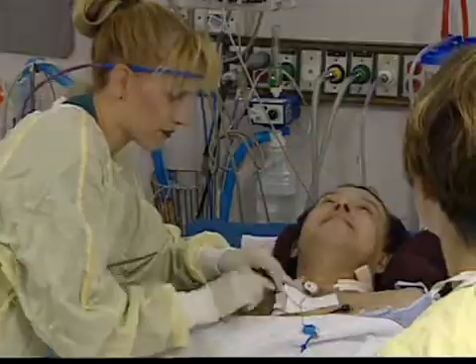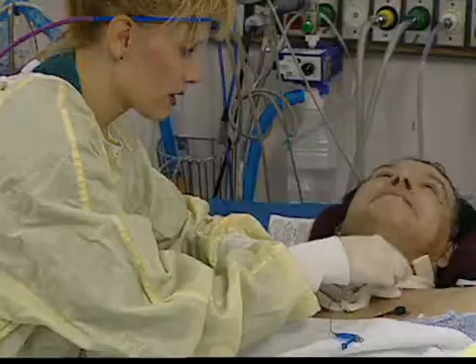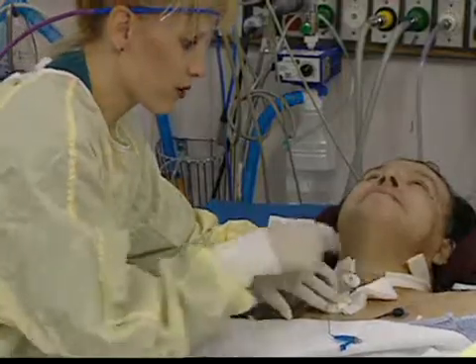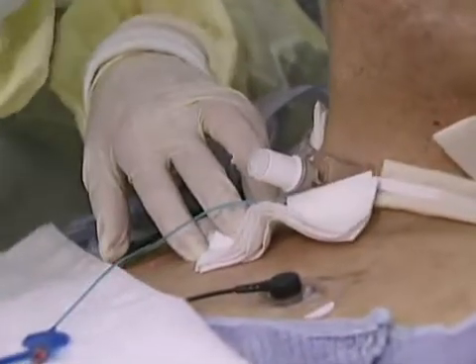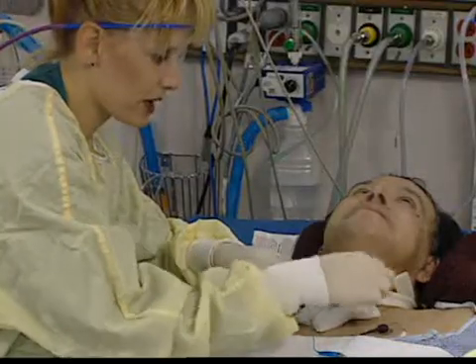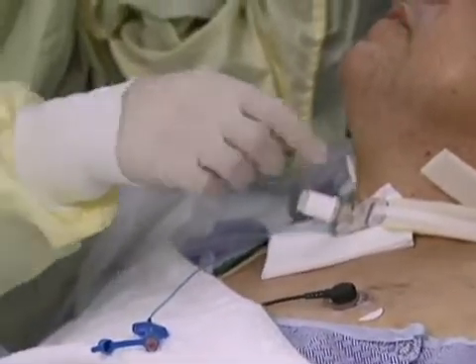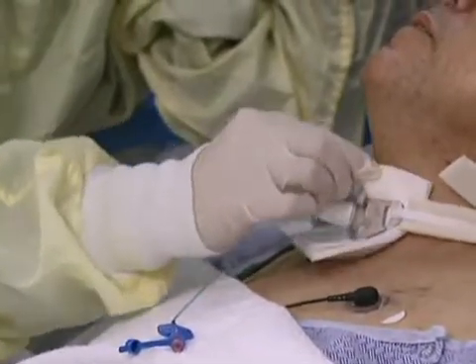I'm sorry, Mr. Gonzalez. And just slowly edge that up, and when you get it up there, it allows that tip to flip up, and you want to make sure that you keep it flat so you don't cause any further skin damage. And the same thing you want to do, you want to take this inner corner and dog ear it and slide it up underneath the trach flange to allow me to have something to grab hold of. And like that. See how that flipped up like that with that dog ear? It makes it a lot easier to have something to hold on to.